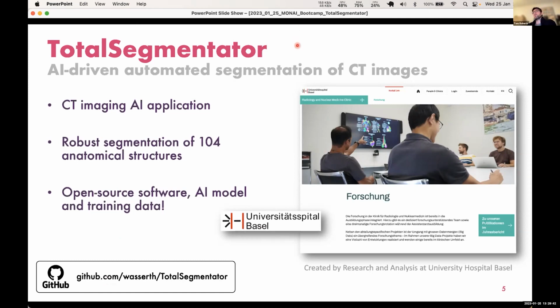So in terms of, I haven't really run into any problems on the input side so far. DCM2NIIX, if we're talking technically, is really robust at converting DICOMs into NIfTIs. They mentioned traceability of the data.